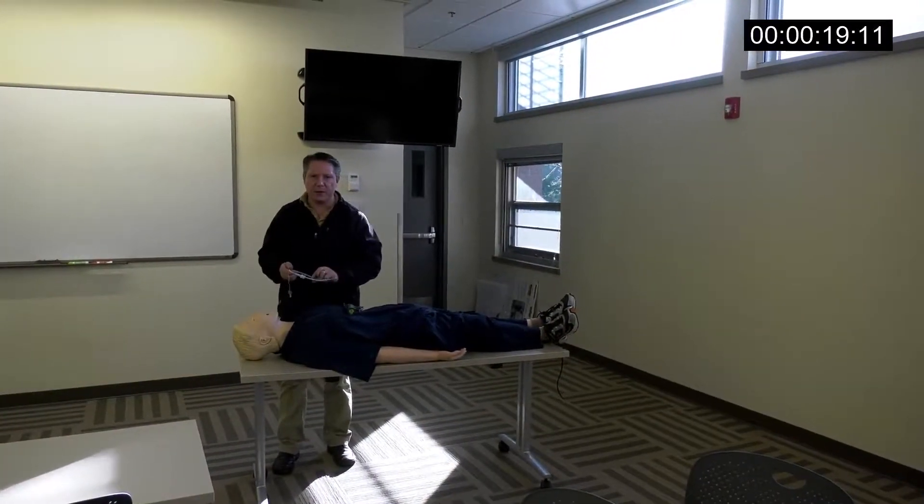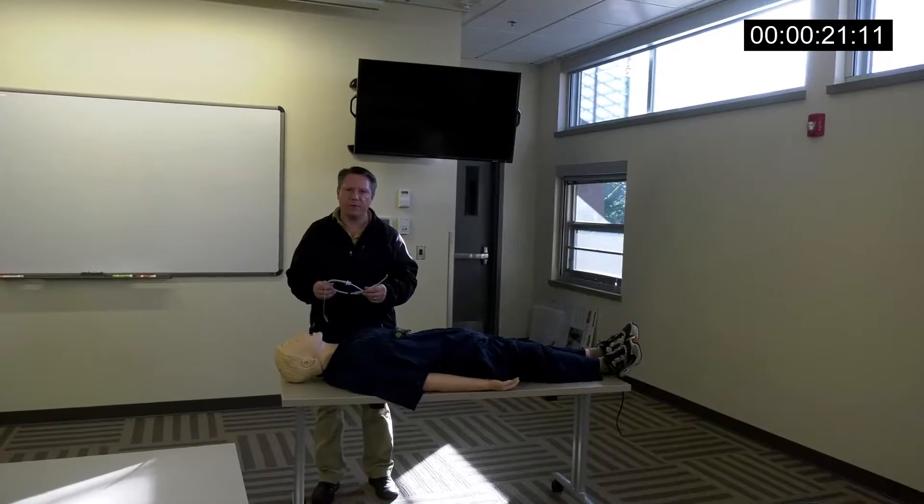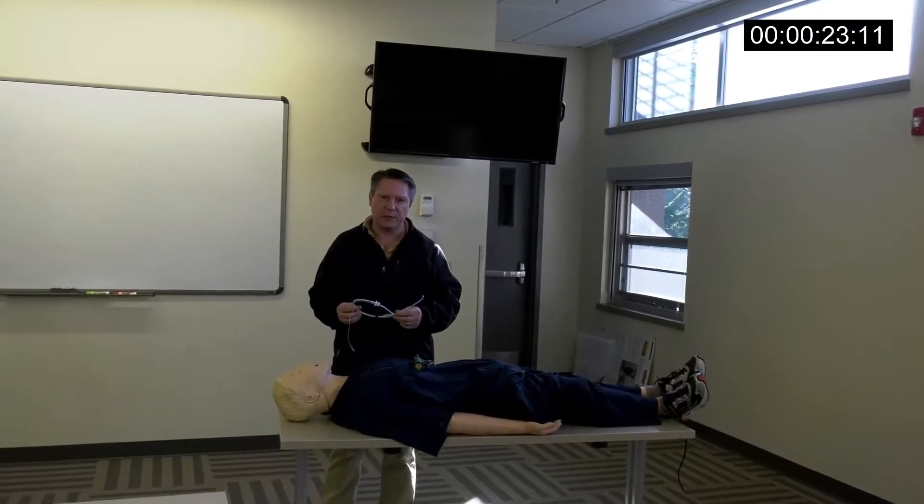Hi, I'm Dana. I'm one of the paramedics at Redmond Medic One, and I'd like to show you a new technique for intubation that is pretty slick.